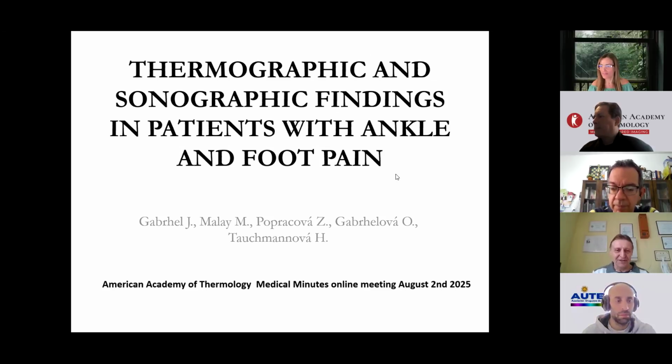Dear friends, dear colleagues, allow me to inform you about thermographic and sonographic findings in patients with ankle and foot pain.